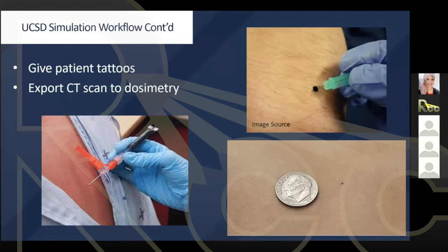Okay, I used to say that this point is named the reference point. It's not the true tattoo, the true ISO.